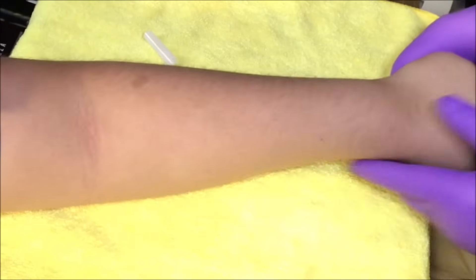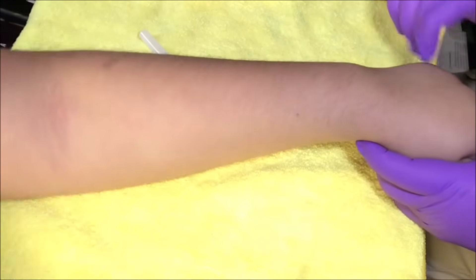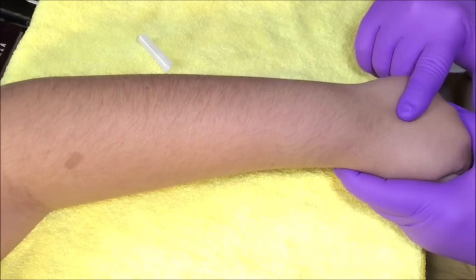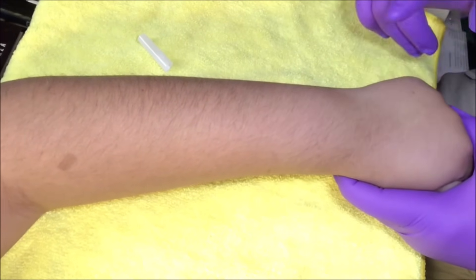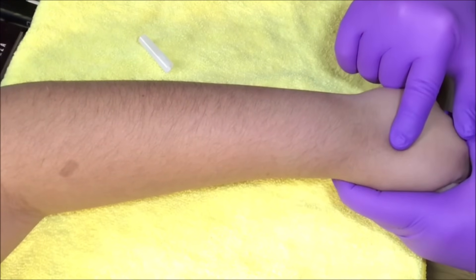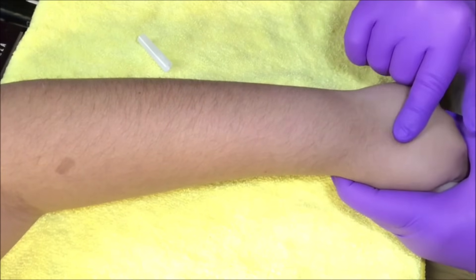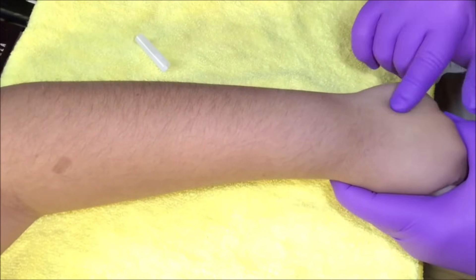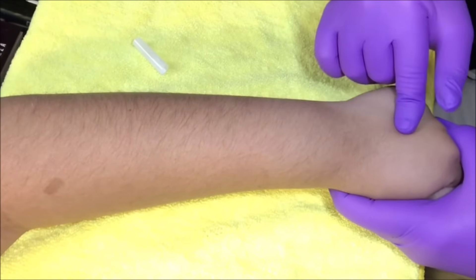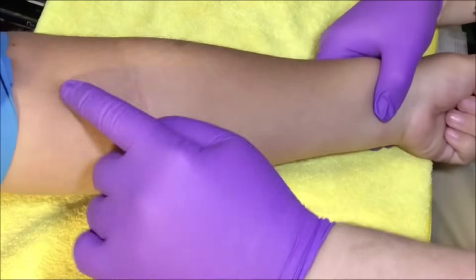On the back of the hands, it can be a little difficult to find veins, but once you push down, if you have someone with larger or swollen hands — maybe from medication — sometimes if you push down, hold pressure, and lift up, it might leave an imprint and you might be able to see the vein through that imprint. Push down here, hold for a few seconds, lift up — sometimes you can see the vein pushed up from the pressure at the skin. The tourniquet should be three to four inches above the site.